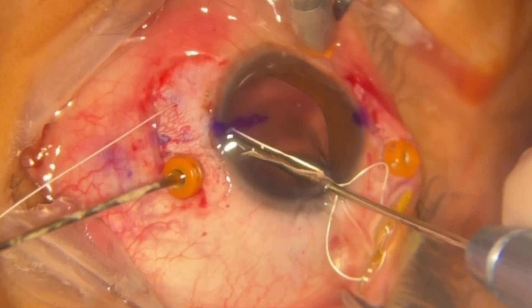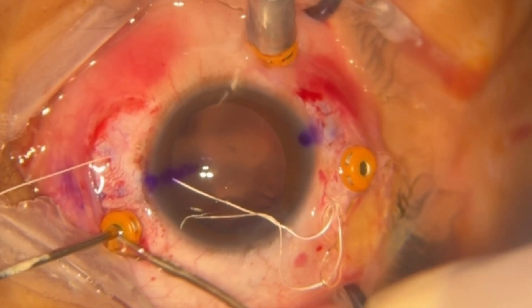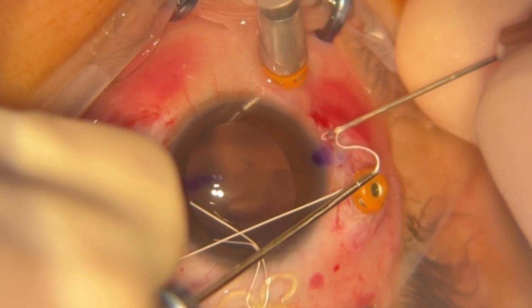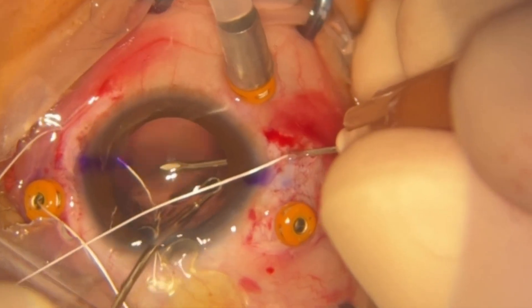With two forceps, the thread is externalized through the superior sclerotomy. The same process is performed on the contralateral side, ensuring that the thread does not cross.